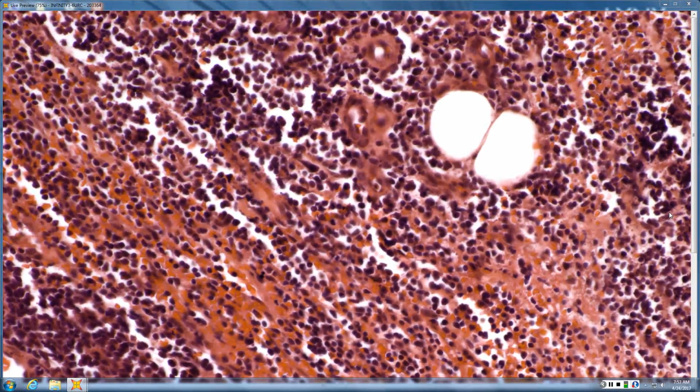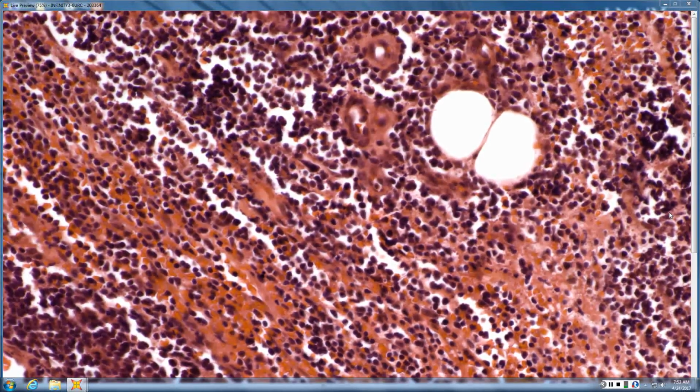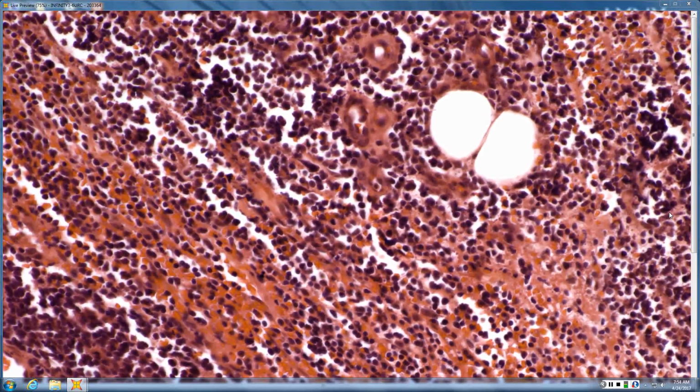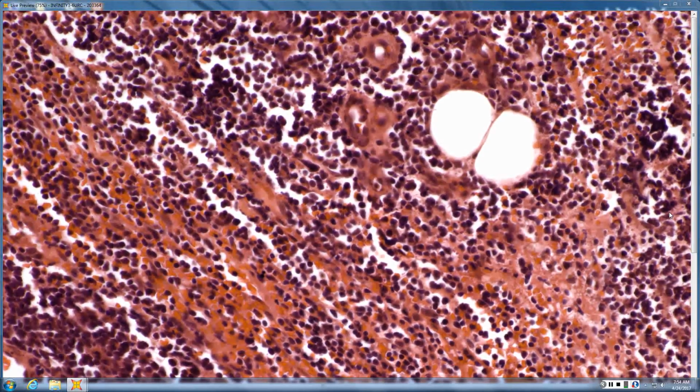It has picked up BCL2 expression, usually lost CD10, about 50-50 whether it retains BCL6 or not. MIB fraction, a little higher than most other lymphomas, maybe 50%, but not 100% like a normal germinal center. And usually you can't make out any follicular network with a CD21 or 23.